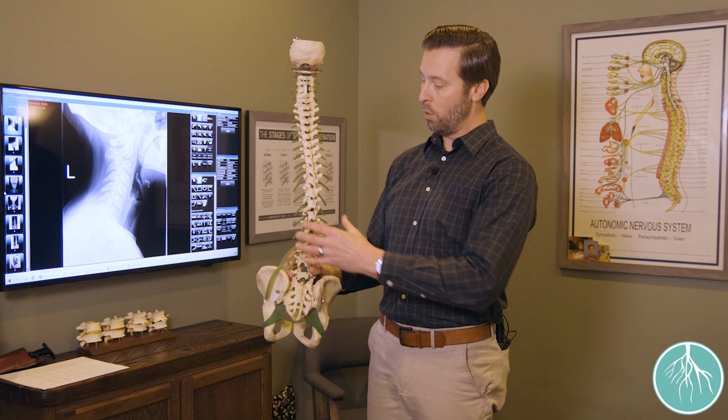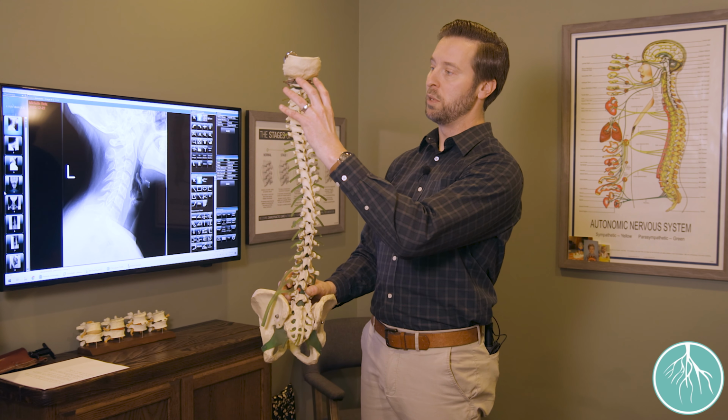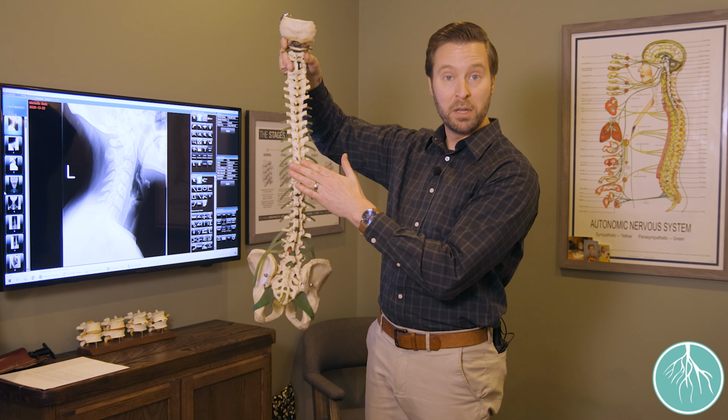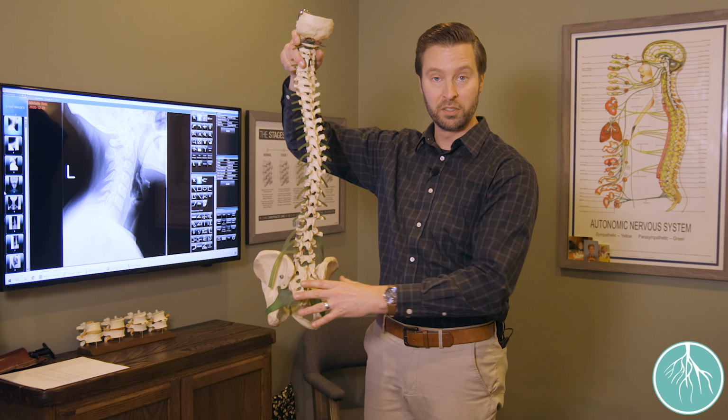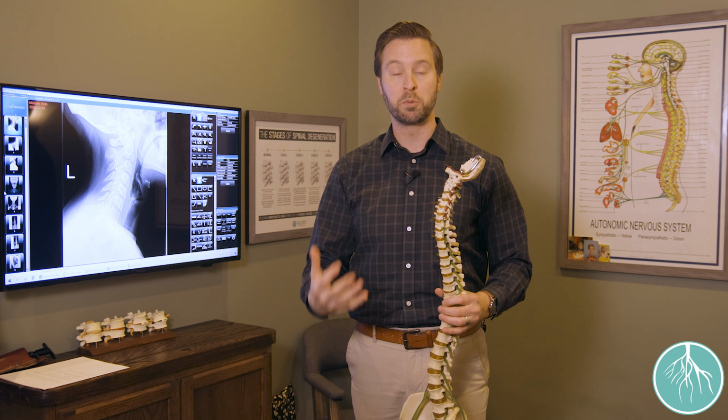So first of all, when we're looking at a spinal column, we do take full spine X-rays, different spot shots beginning up in the neck. We look at the back of the spine, we look at the side of the spine, and then coming down, we look at the back and the side of the mid-back, low back, and pelvis. In all, we get a whole complete 360-degree view of your spine.